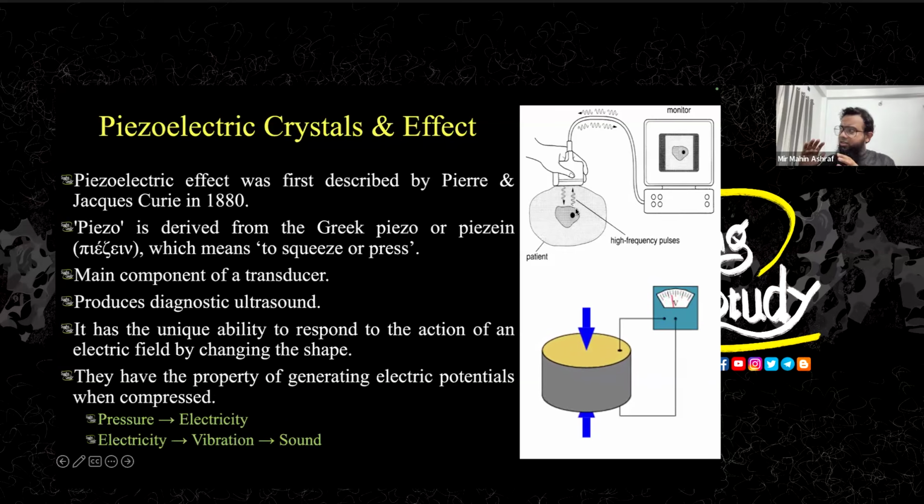Have you seen the waves from the sea or from a river? When they come, they give you a pressure, like when you are in the middle of the sea and a big wave comes to you. When it touches you, you feel a pressure. These sound waves also create some pressure. This pressure is then converted into electricity. This is the mechanism of piezoelectric crystals, and this is called the piezoelectric effect.